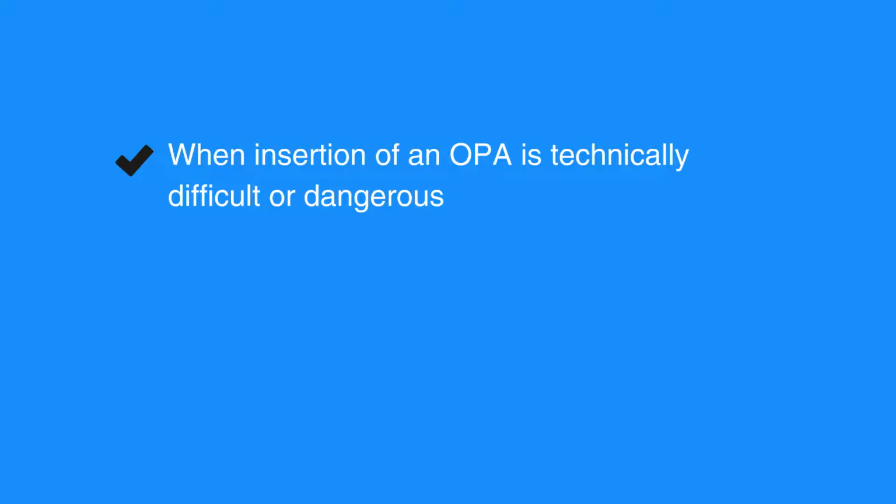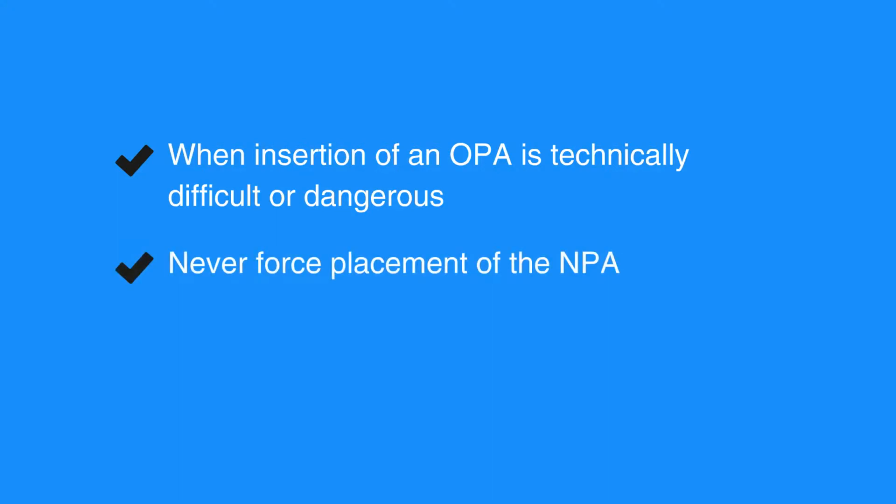NPA placement can be facilitated by the use of a lubricant. Never force placement of the NPA, as severe nosebleeds may occur. If it does not fit in one nare, try the other side. Use caution or avoid placing NPAs in individuals with obvious facial fractures.